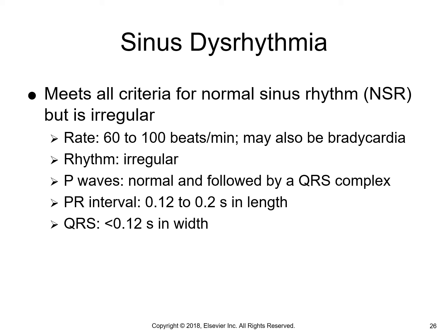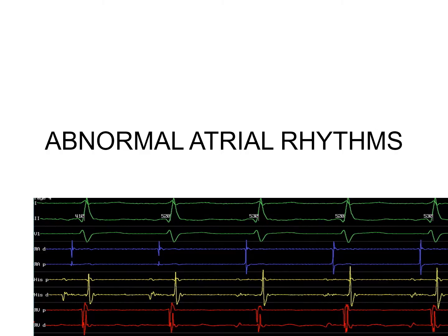So these could be rhythm changes associated with respirations. When your heart rate goes up with inhalation, it can go down with exhalation. It's more common in children and young adults, and it's generally asymptomatic, so it's nothing to get too terribly concerned about, unless you become symptomatic.